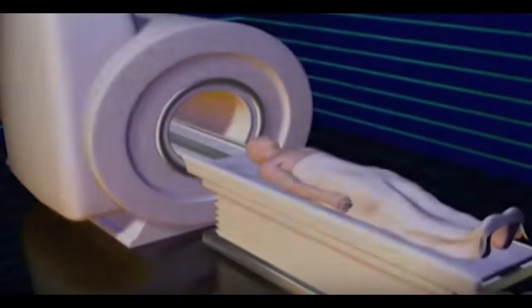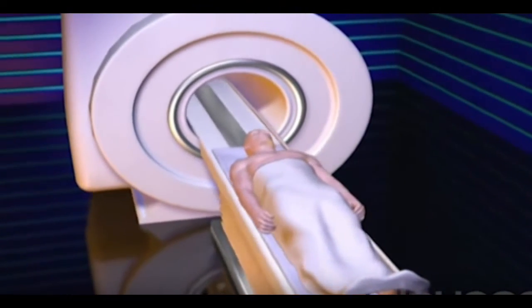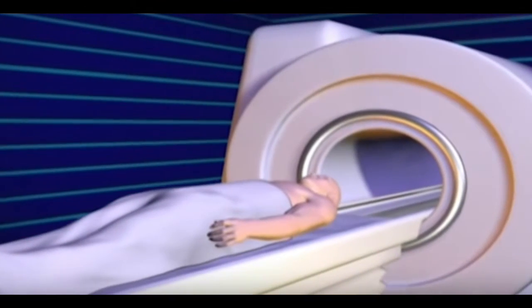Magnetic resonance imaging, commonly known as MRI, is one of the most powerful tools doctors have at their disposal to diagnose all sorts of ailments and make treatment plans to heal those which are sick.